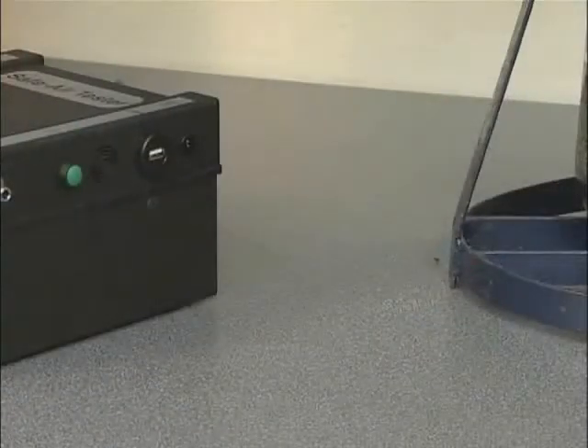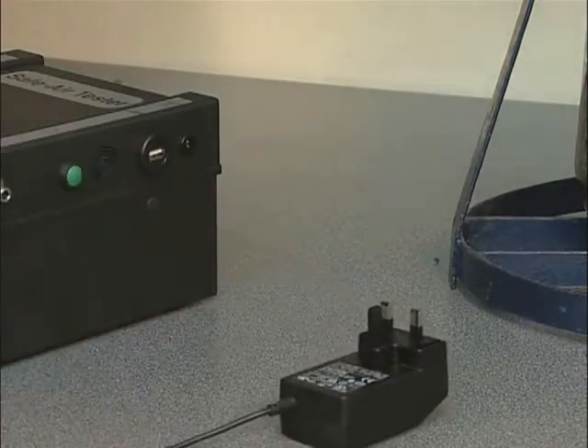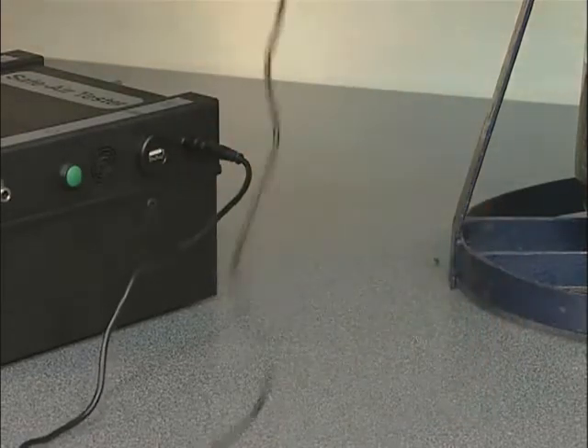If the tester is to be used adjacent to a power socket, the mains adapter may be used. Please note that the unit should be switched off prior to connection or disconnection of the mains supply.